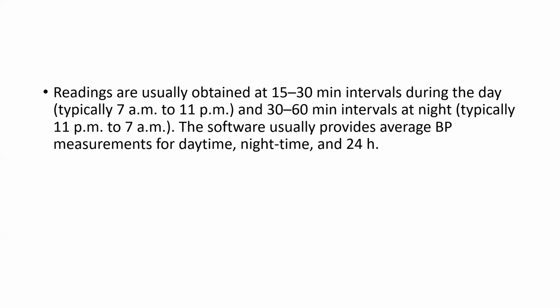Recordings are usually obtained at 15 to 30 minute intervals during the day, typically 7 a.m. to 11 p.m., and 30 to 60 minute intervals at night, typically 11 p.m. to 7 a.m. This is different from the 2023 guideline, but anyhow it's 30 to 60 minute intervals at night. So the software would provide average BP measurements for daytime, nighttime, and 24 hours.